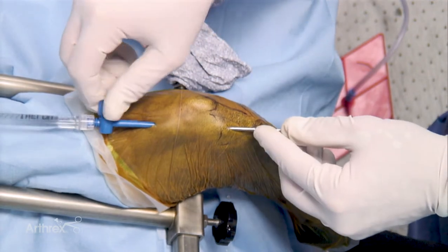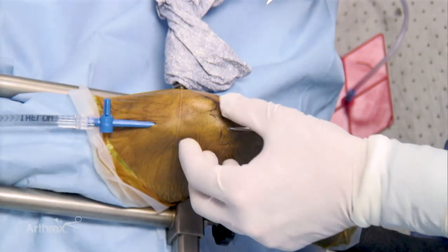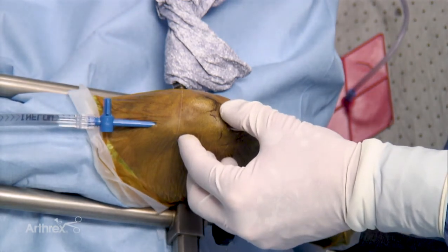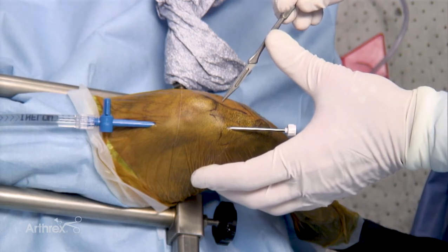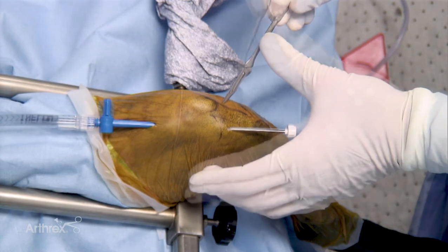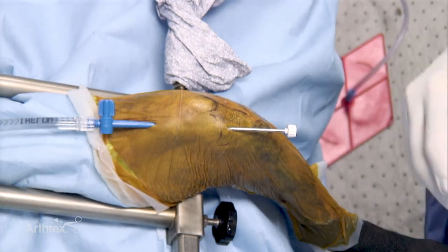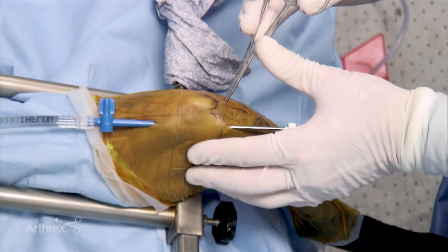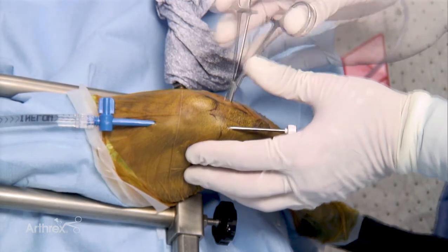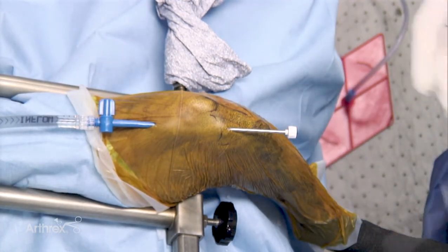At this stage the fluid is closed and the second port on the lateral aspect can be established. Palpation of the patella tendon is important. The second port is placed equidistant from the patella tendon as the medial port and at the same position proximo-distally. Recommencing fluid flow at this point will allow proper evaluation of port depth. Use of the straight hemostat to distend the port is recommended. This will be primarily a scope portal and should not be too large.